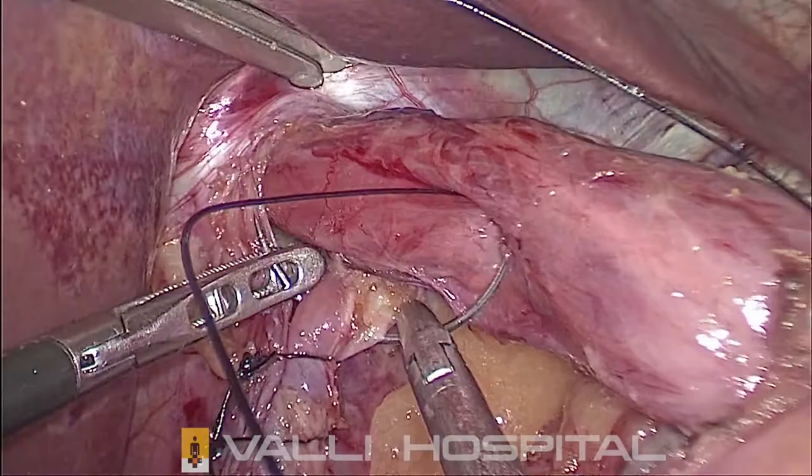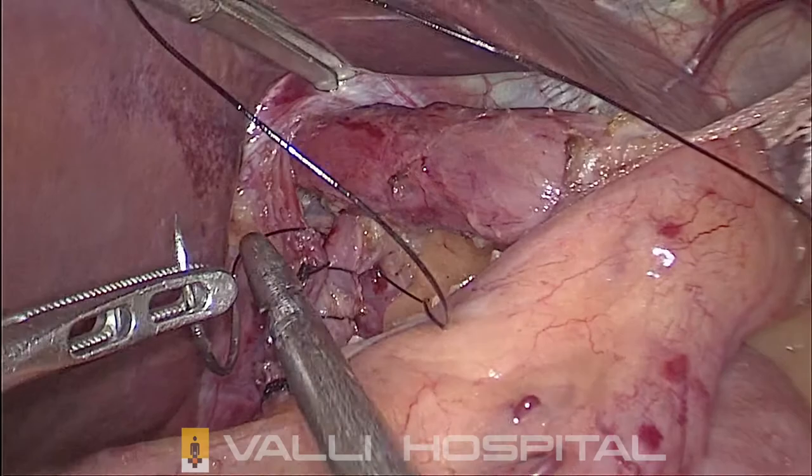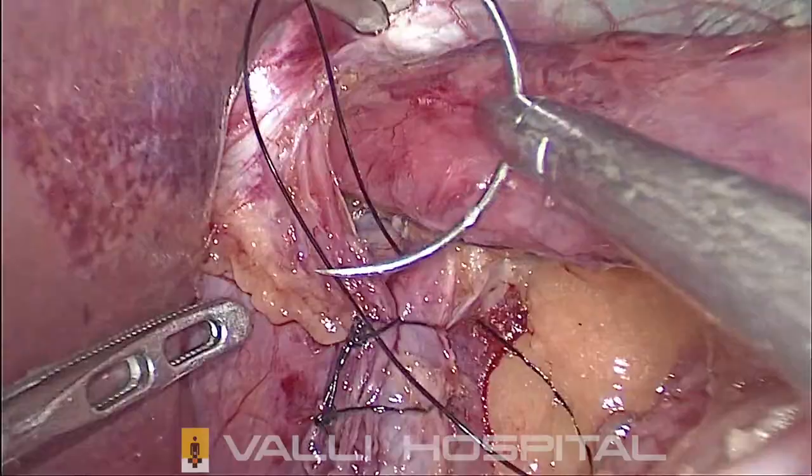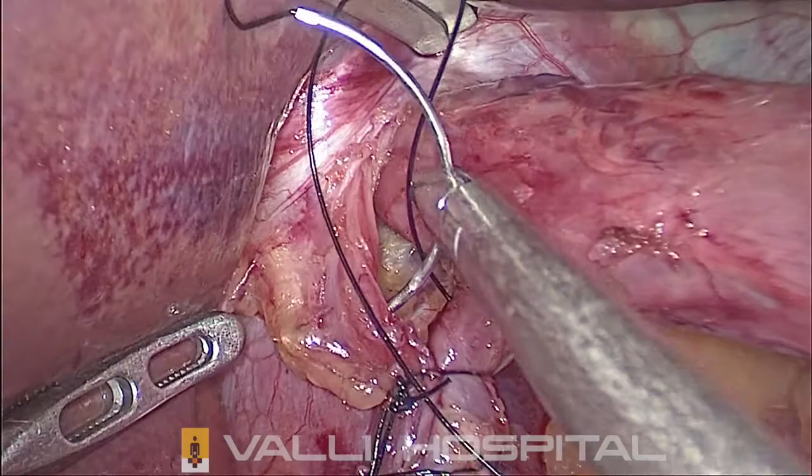While taking the bite on the right crus, you have to take the bite a little lower down. You should not go up. If you go up, you will strangulate the esophagus. It will cause obstruction. So come a little lower on the right crus, lower down. Yeah, that's ideal.